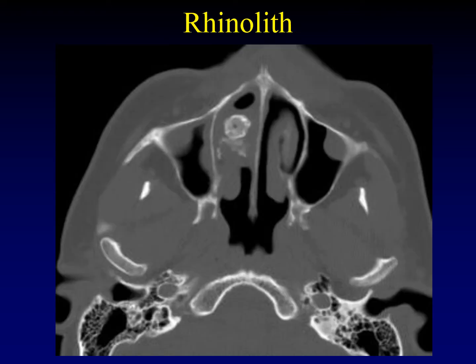Inspissated and trapped secretions within the nasal cavity can sometimes calcify and form what we call a rhinolith. These tend to have dense calcifications around the periphery and occur in characteristic locations in the anterior nasal vault.